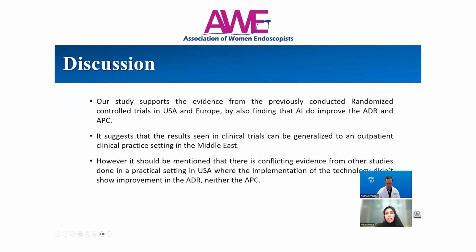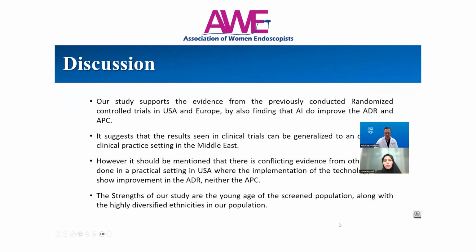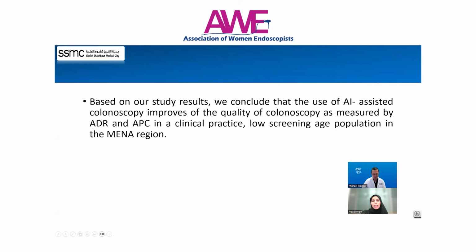However, it should be mentioned that there is conflicting evidence from other studies done in a practical setting in USA, where the implementation of the technology did not show improvement in the ADR, nor the APC. The strengths of our study are the young age of the screened population, along with the highly diversified ethnicities in our population. Based on our study results, we conclude that the use of AI-assisted colonoscopy improves the quality of colonoscopy as measured by ADR and APC in a clinical practice, low screening age population in the MENA region.